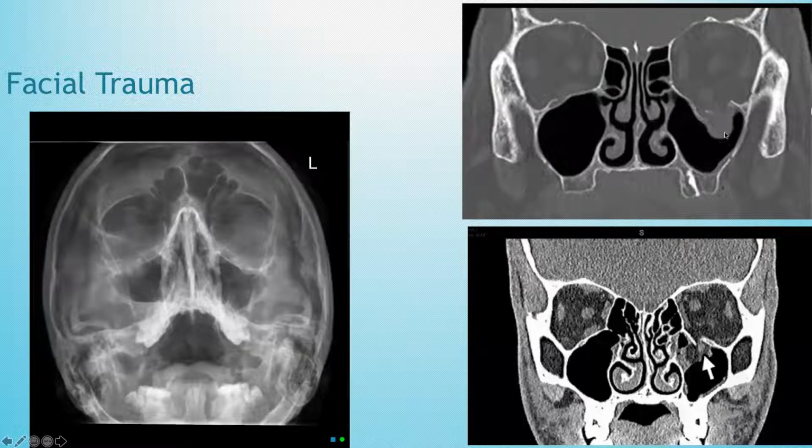During the CT now, you can actually see that the muscles have dropped into it, the bone window and the soft tissue window, and you see prolapse of the muscles. You see the muscle itself. So you can see stuff with plain X-rays. And I mean, if you're in a situation where that's all you have, well, use it.